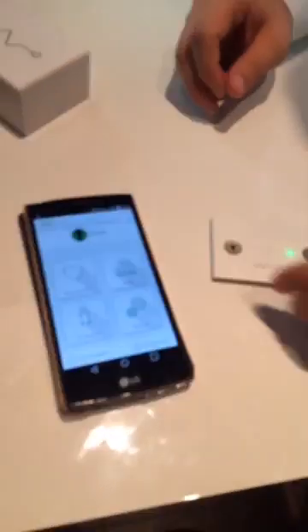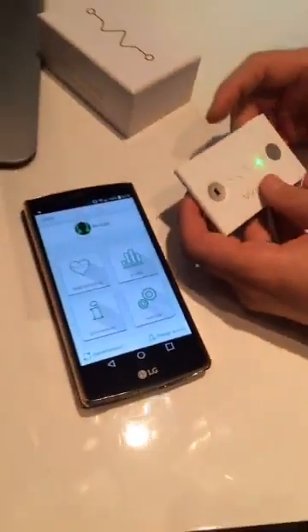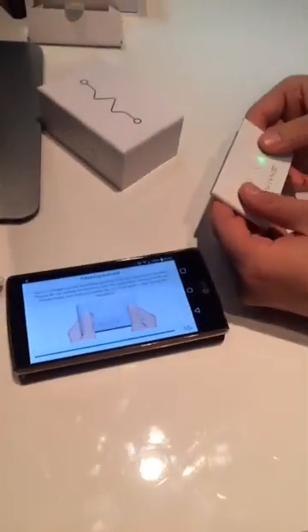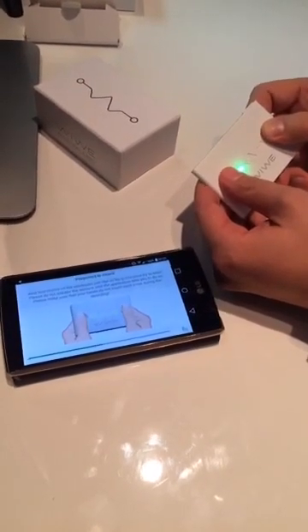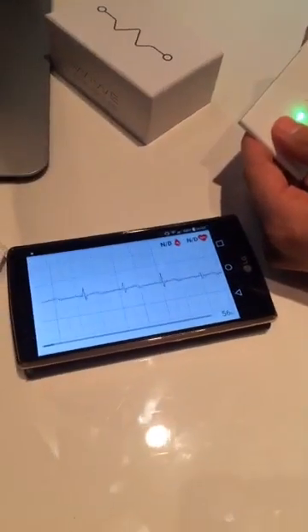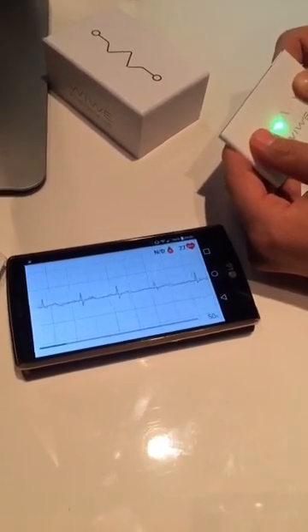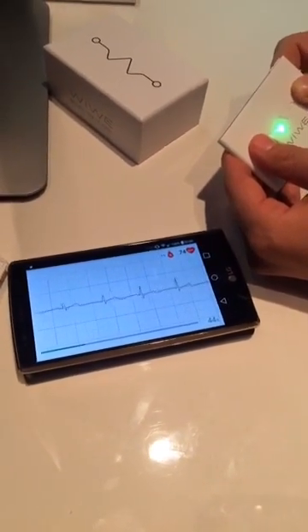Now let's do a recording — let's see what the device can do. I will try to do it in a way that you can see both the smartphone and my Vive device. Let's do a new recording. I just have to hold it comfortably like this. Preparing to record — in about six seconds it's going to record my EKG. It's going to record my blood oxygen levels and also my pulse. It takes precisely one minute to finish the recording. What we see now is my one-channel EKG out of the possible 12 channels.